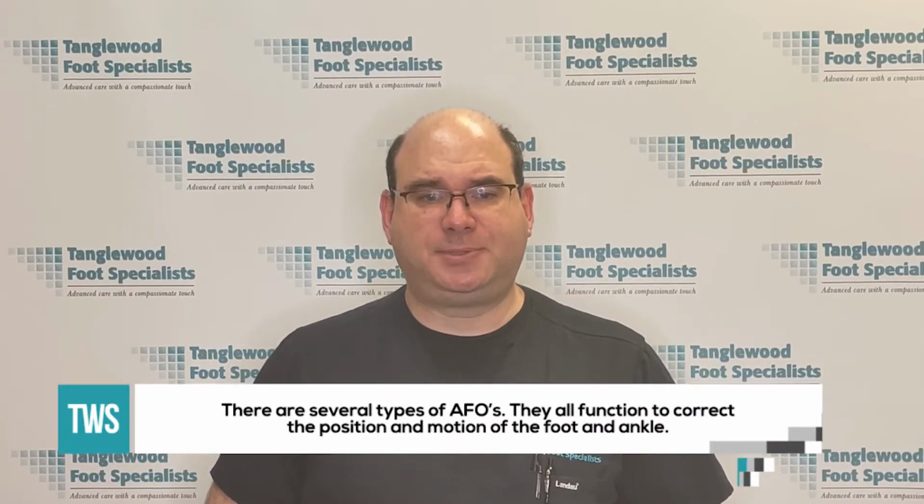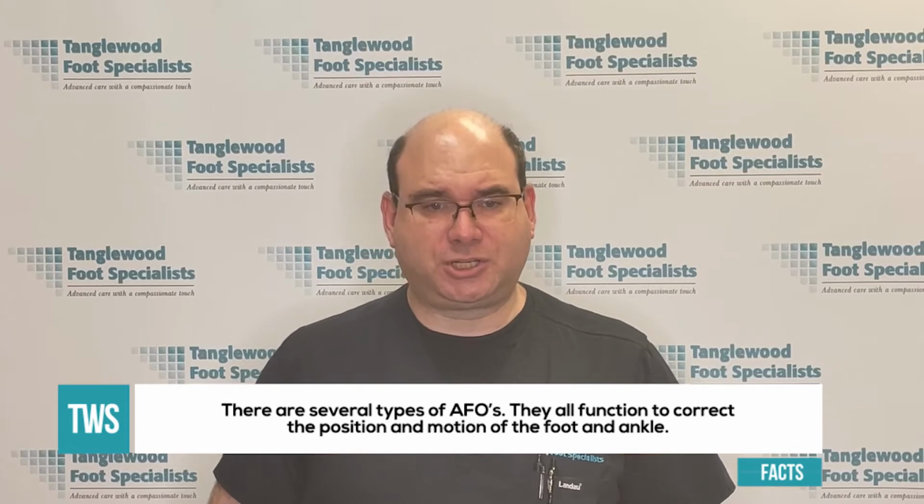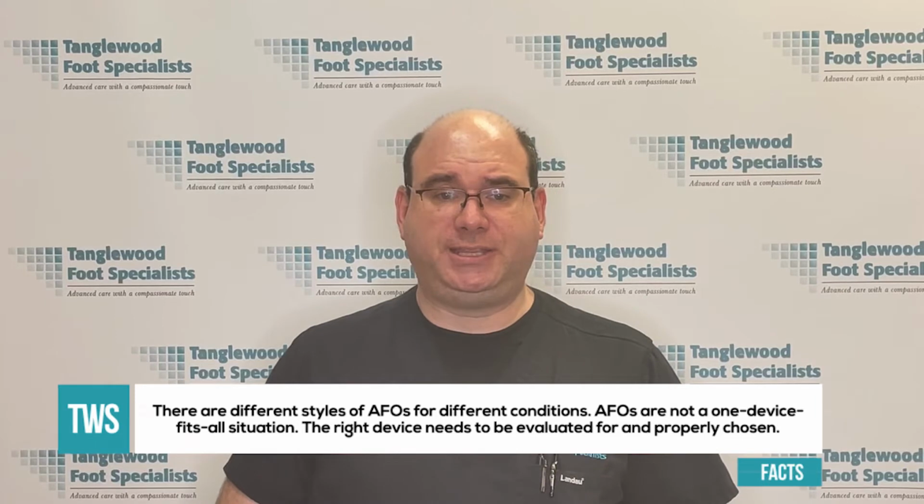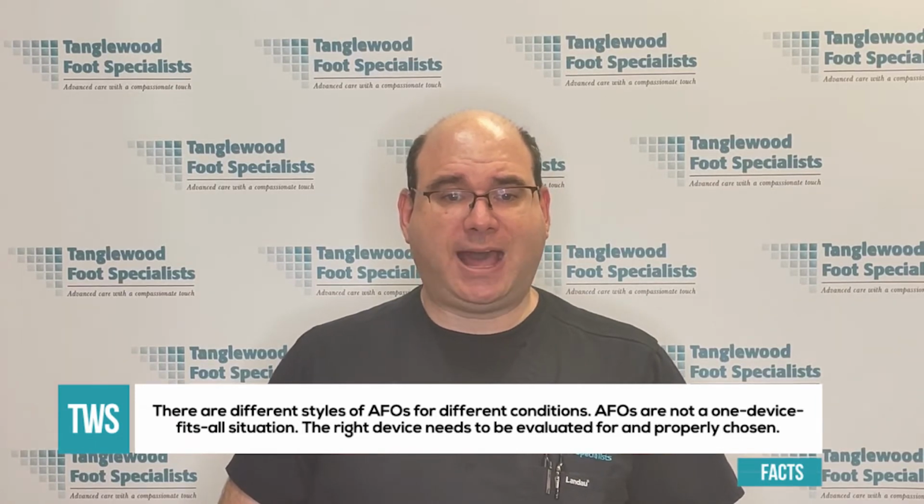There are several types of AFOs. They all function to correct the position and motion of the foot and ankle. They also compensate for lower extremity weakness. That said, there are different styles of AFOs for different conditions. AFOs are not a one-device-fits-all situation. The device needs to be evaluated and properly chosen for each patient.